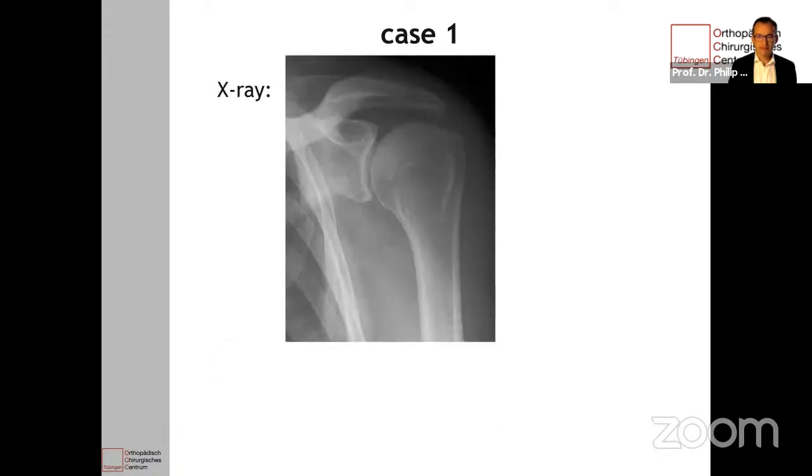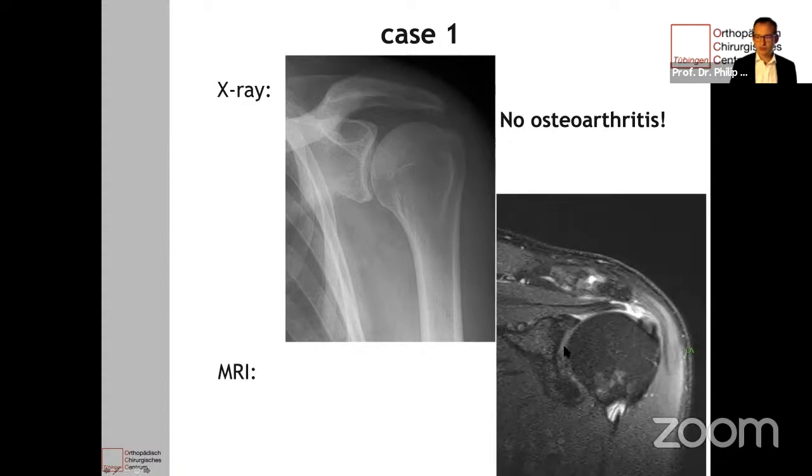I brought you the AP view of the X-ray, and you can see that he has no osteoarthritis — the humeral head is smooth. Maybe he has some osteoarthritis at the AC joint, but this was not tender. Because of the reduced force for abduction, I ordered an MRI and I show you the coronal view. You see here the humeral head, the glenoid, the supraspinatus muscle that becomes the tendon, and you see this gap filled with fluid — this represents the tendon rupture.